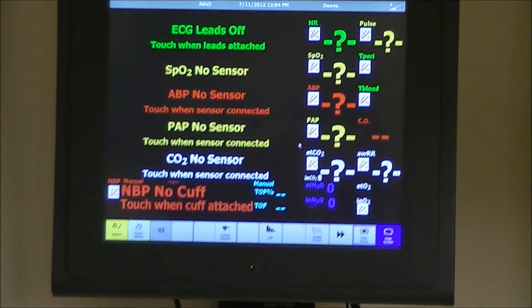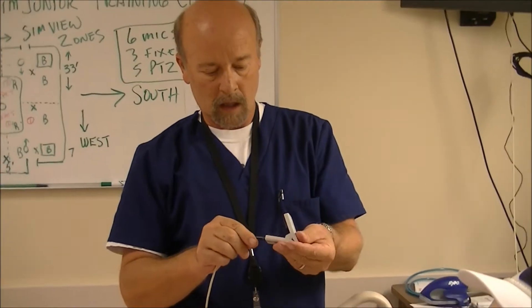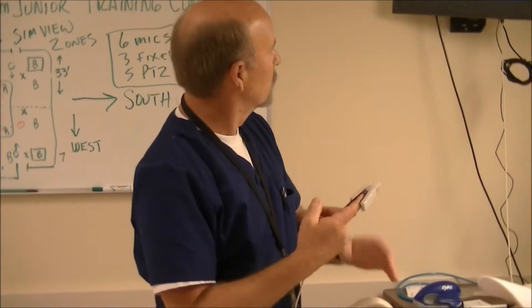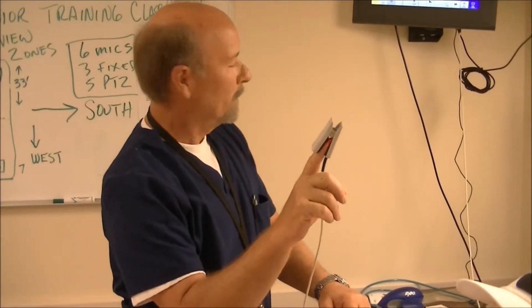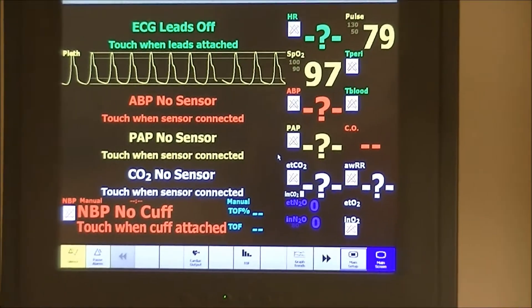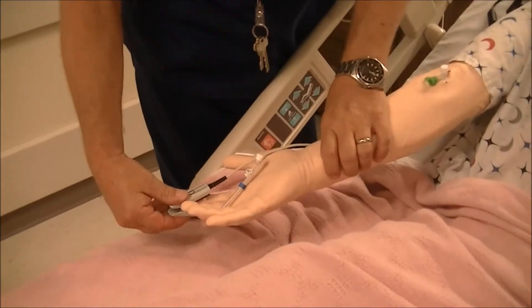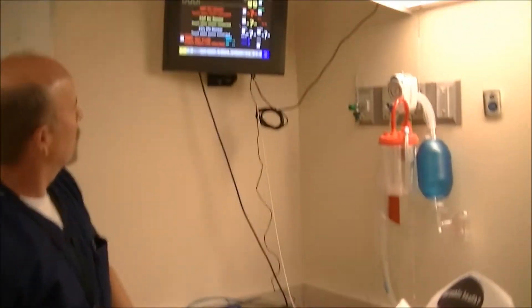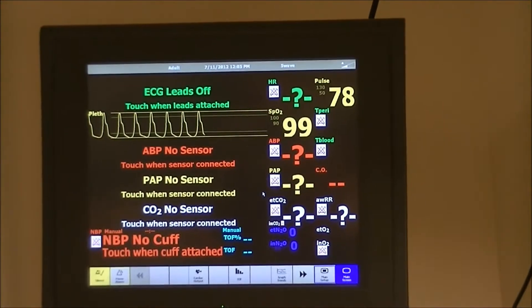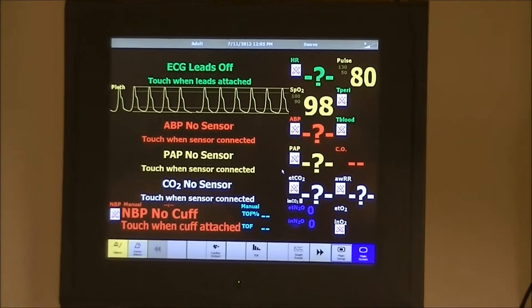First thing we're going to look at is his pulse oximeter, just like a pulse oximeter that you would find in the hospital. It's looking for a signal on me. Fortunately, I'm in pretty good shape — I'm generating 97. I've got a pulse oximeter reading, a SAO2 of about 97, 98. So now we're going to see if we've got one on Fred. Put it on his finger there. Fred's actually doing about the same as I am — 97, 98.